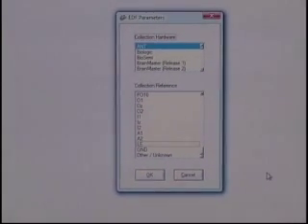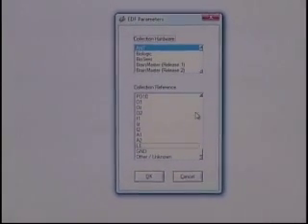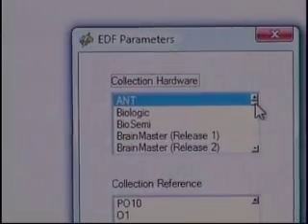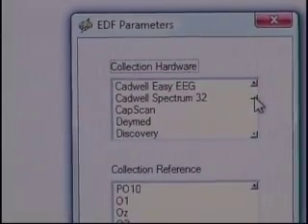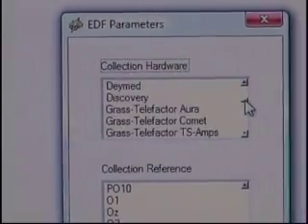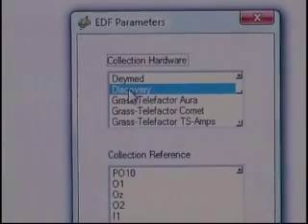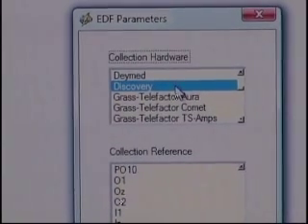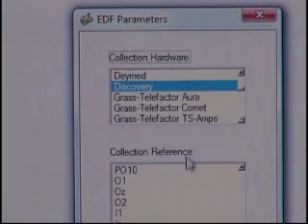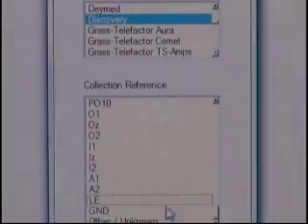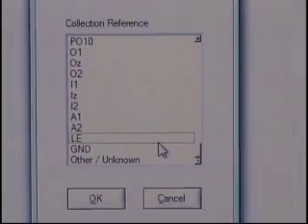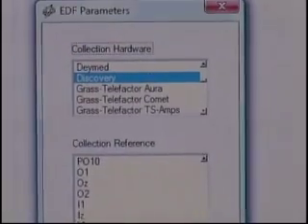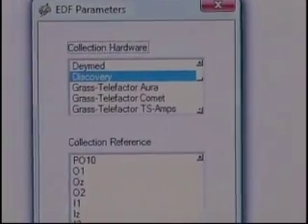Next we get the EDF Parameters file. What we need to do is go down to Discovery to tell it that it is a Discovery amplifier. It's already figured out that the reference is linked ears, so we can leave this alone. Having picked Discovery, we next just hit OK.